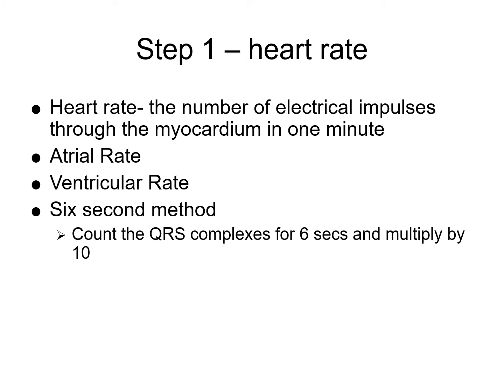All right, so the heart rate. Again, we're looking at the atrial rate and the ventricular rate.